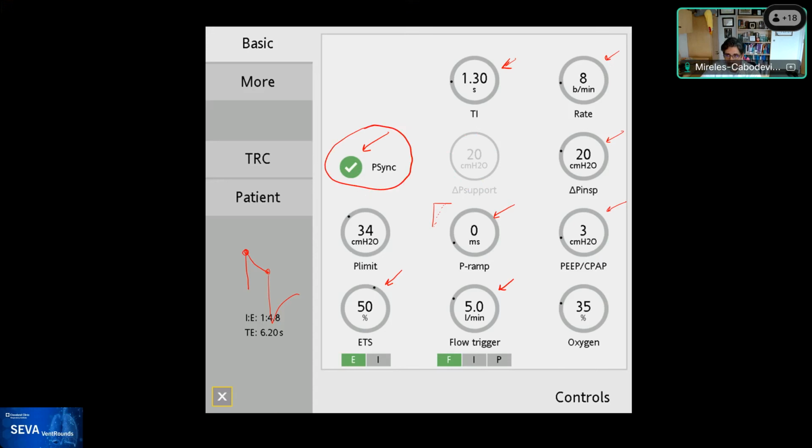Rob? Yeah, and just to add, keep your eyes peeled because we're working on a paper that tells how to recognize these different types of IMV based on what the manufacturers say. If you read between the lines, it says what the vent is doing, but of course they don't use our terminology. So you have to read what they say, think about what it means, and then classify it. And this is not necessarily wrong. This is not a bad button in any shape, way, or form. It's just something that you need to know how it acts.